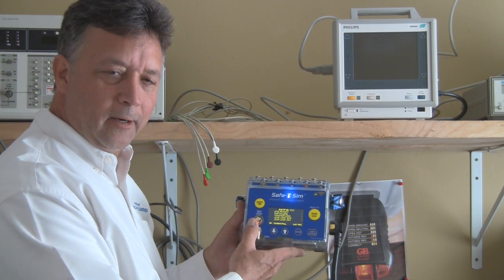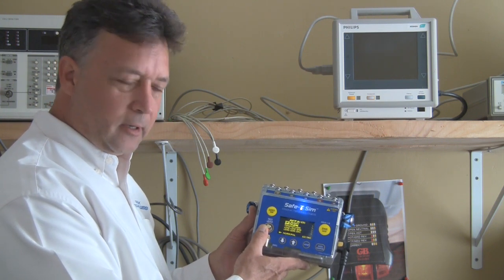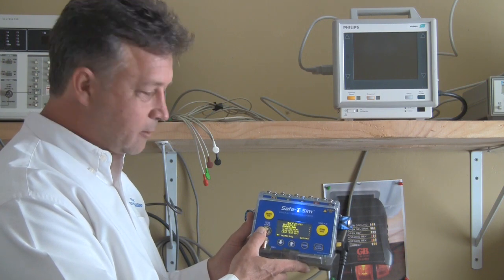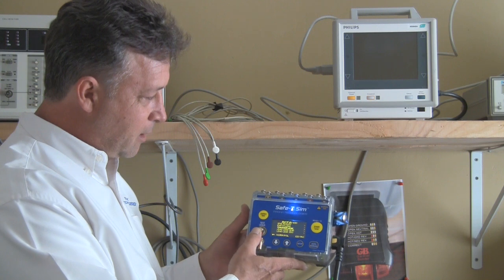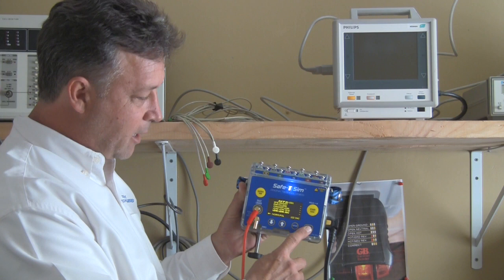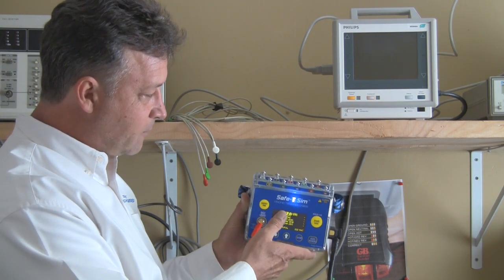I'm Greg Alcaire with Pronk Technologies and I wanted to do a quick presentation on our newest product, the SafetySim Electrical Safety Analyzer. Just a quick overview: we've got electrical safety modes, both manual and auto, and you've also got a simulator mode that you can select from the device.